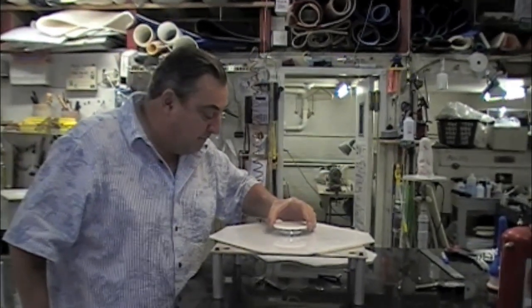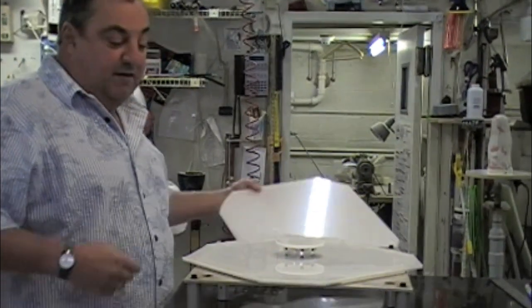That gets centered over that, and then the final piece goes over that.